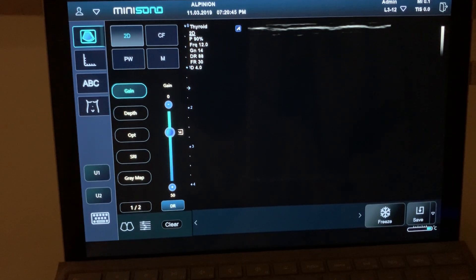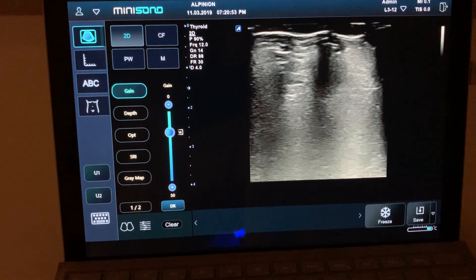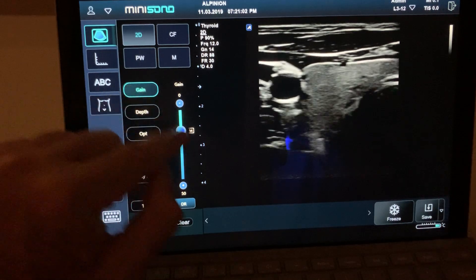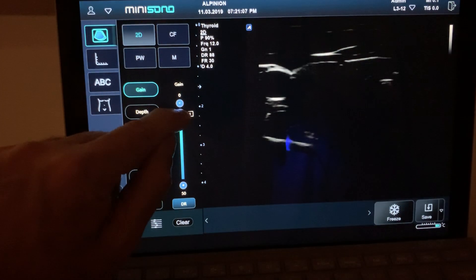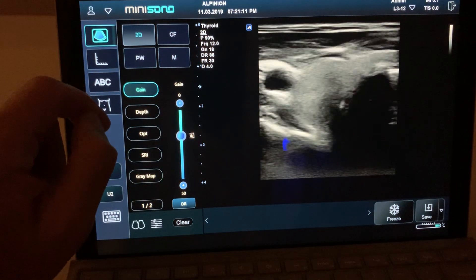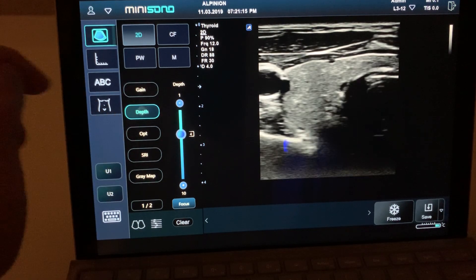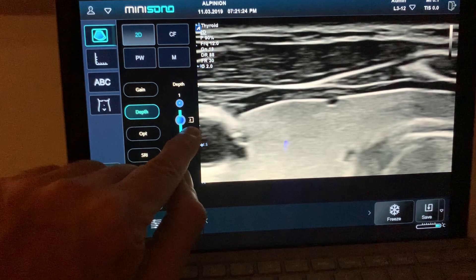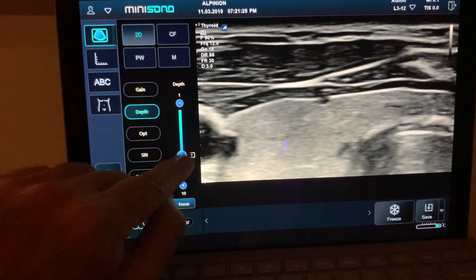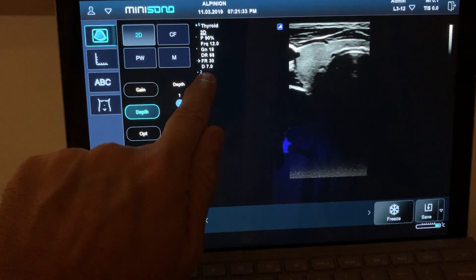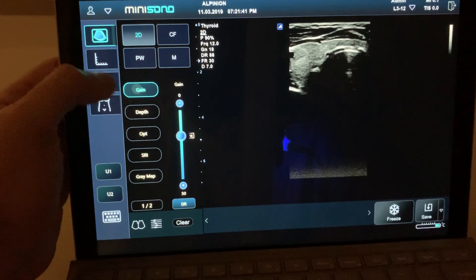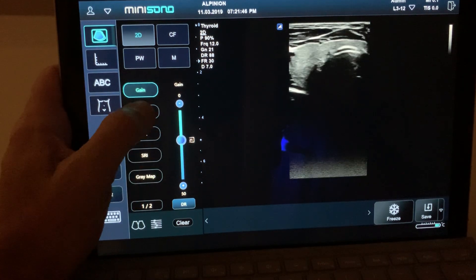The basic ultrasound controls are gain and depth. To change the gain, you see 'gain' on the left side of the monitor with a slider — move it down to get more gain or up to get lower gain. To change the depth, click where it says 'depth' and this slider will let you move the depth. The number shown indicates the depth in centimeters. For example, if you move it to seven, the machine is at seven centimeters as shown by the scale.